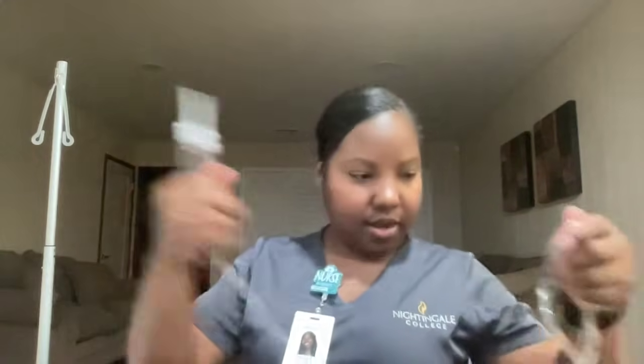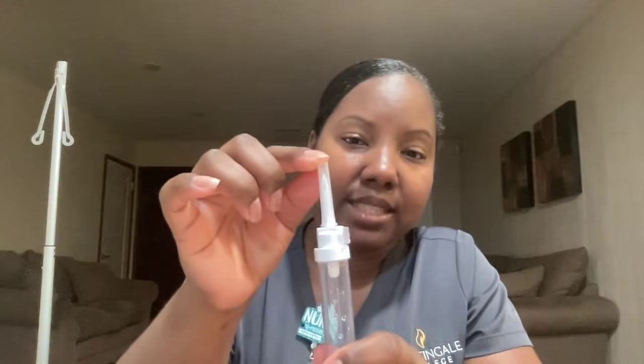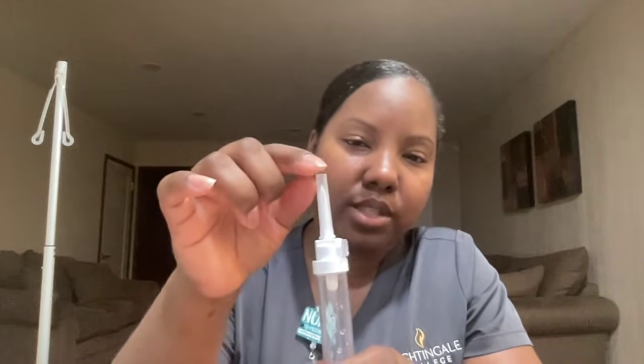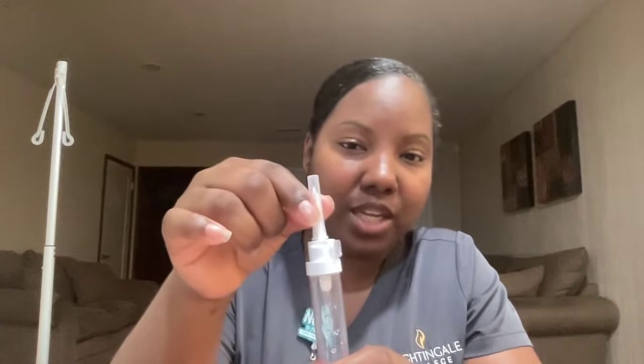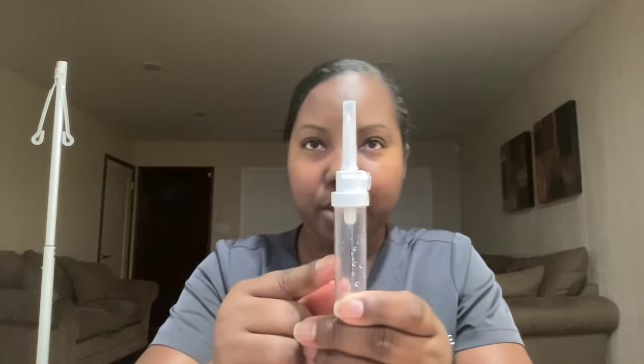So the parts of the tubing. We have the spike end. This is the end that will be spiked directly into the IV bag, so it's important to keep it covered until you're ready to use it. It should be sterile. You have your drip chamber. This prevents any air from going into the tubing, and it also allows you to visualize the flow rate.